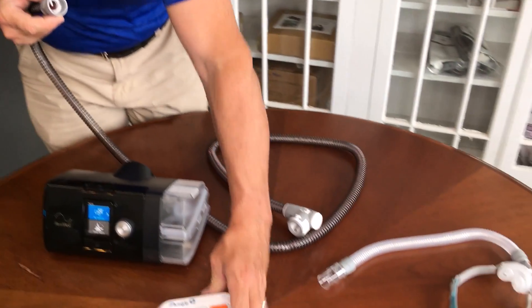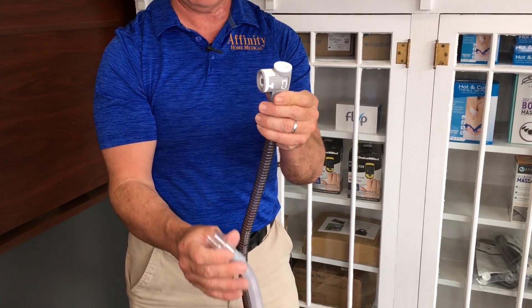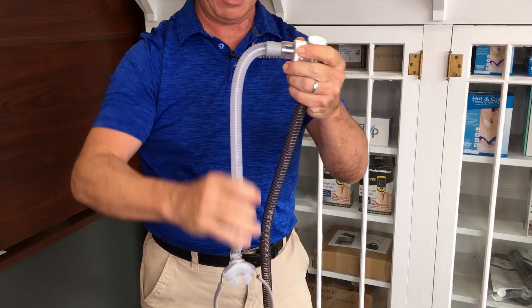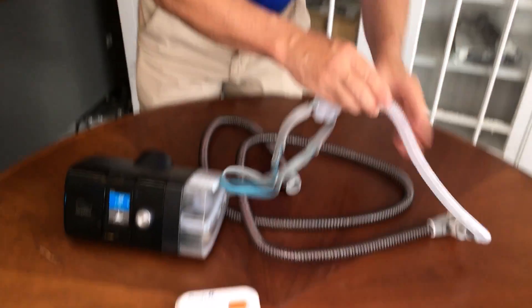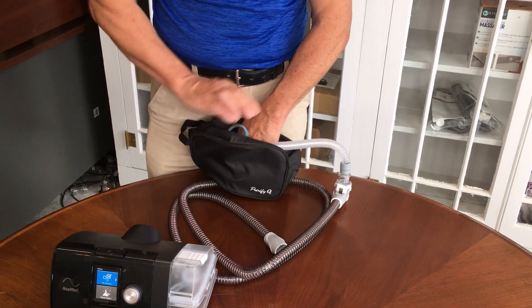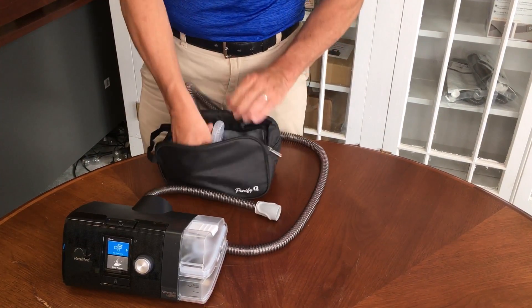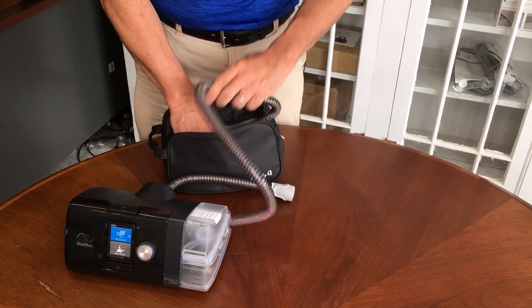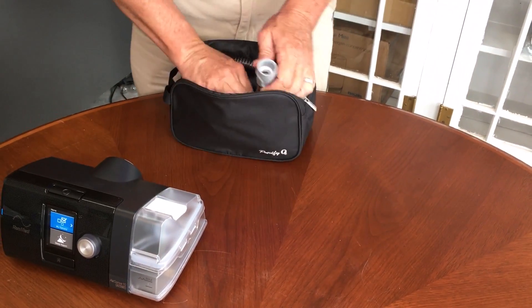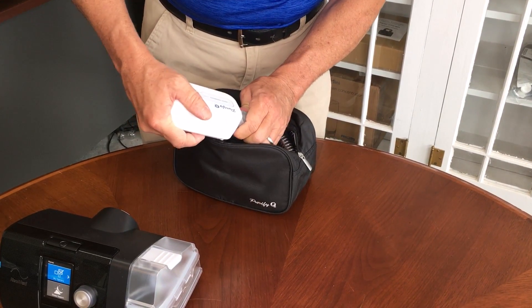Let me set the Purify O3 aside. The end of the heated hose that connects to the CPAP machine is now going to be where you connect your mask to the system — just get that connected. We want the ozone that the Purify O3 creates to actually flow through all of the tubing, and that's the reason we're connecting it up this way. Once you have that, just place your mask and all of this tubing into this bag like so. The end that we're going to connect to the Purify O3 will now easily connect right on there.